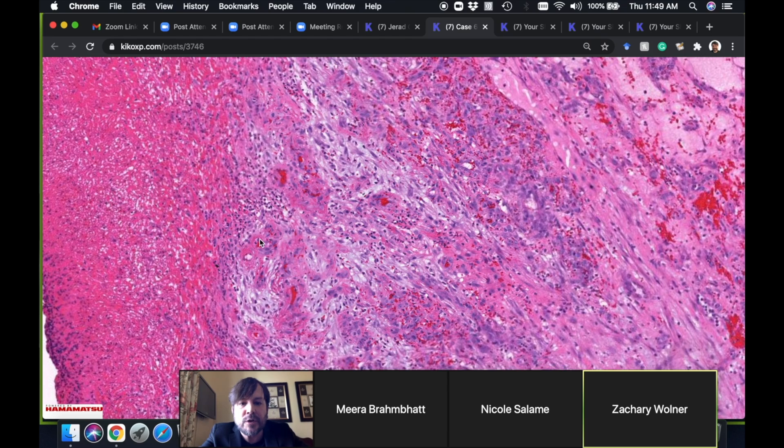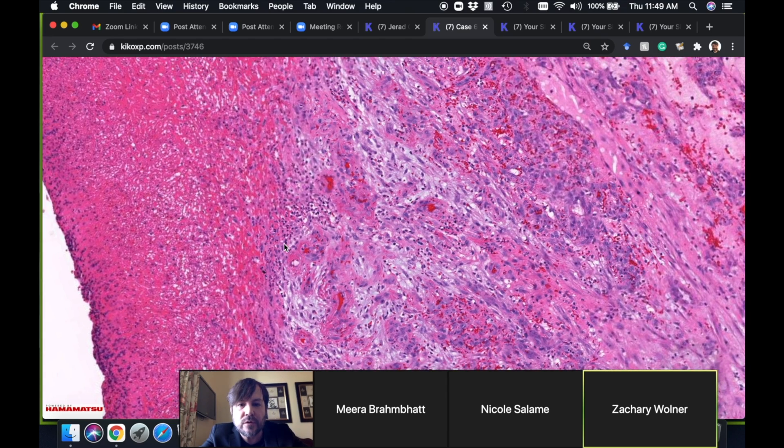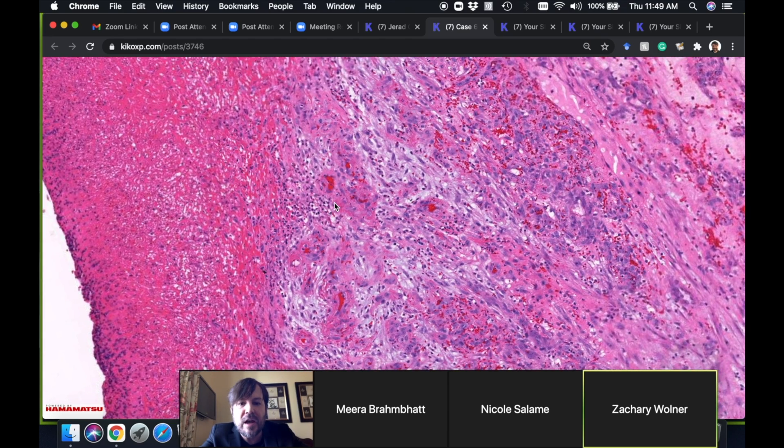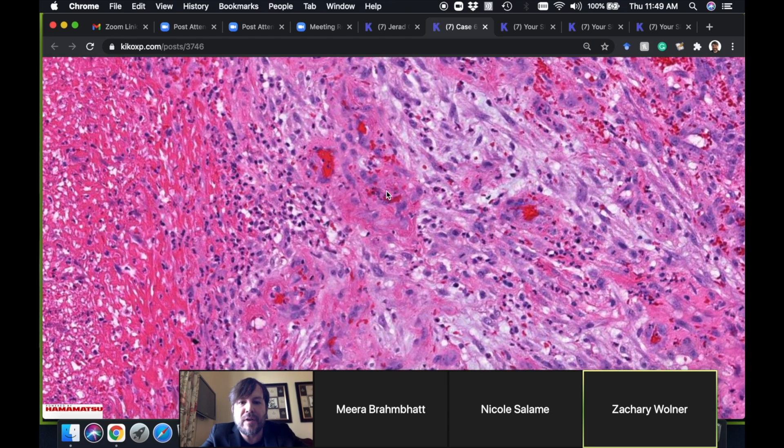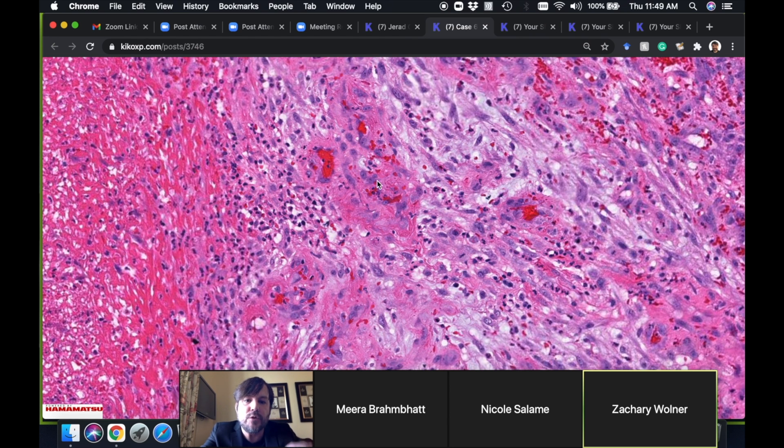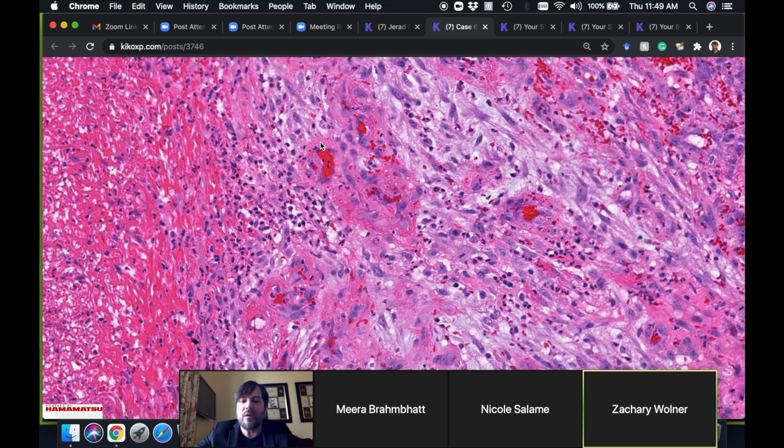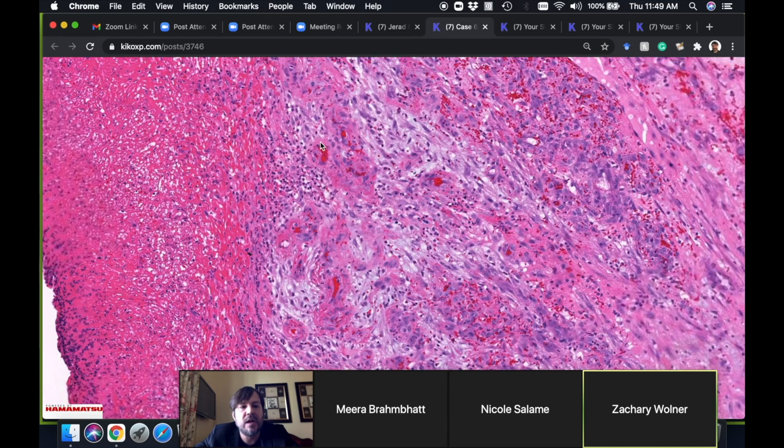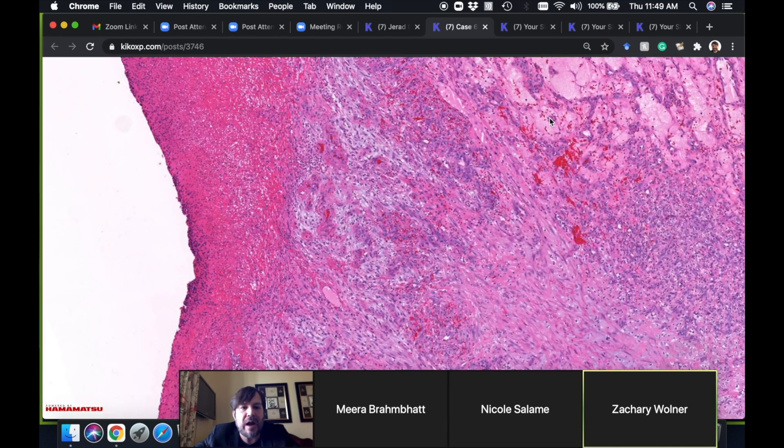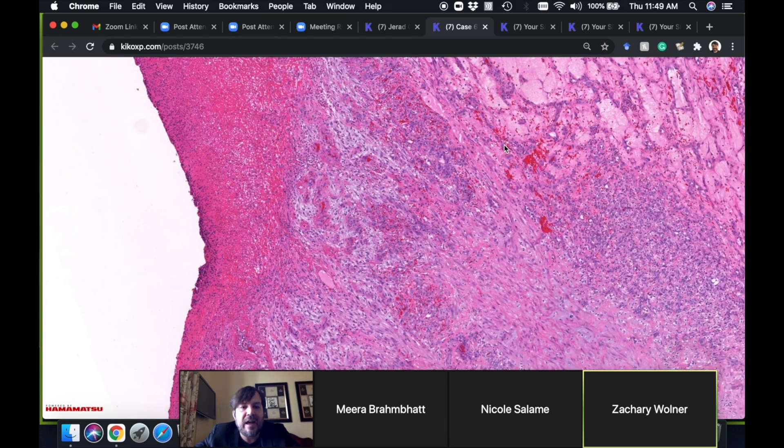Bacillary angiomatosis tends to have a lot of neutrophils in it. If I start seeing a bunch of neutrophils in the middle of a PG, I go looking around for those bacterial colonies. I got a video on YouTube about that you can check out if you need. Sometimes there's a lot of hemorrhage and fibrin around the vessels.